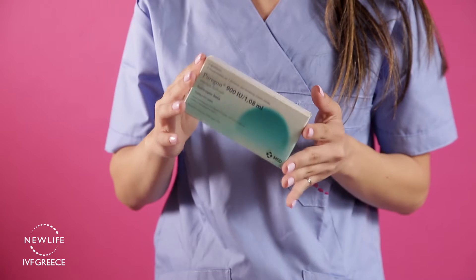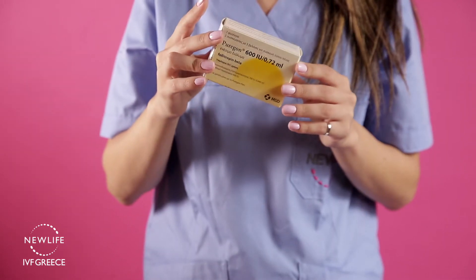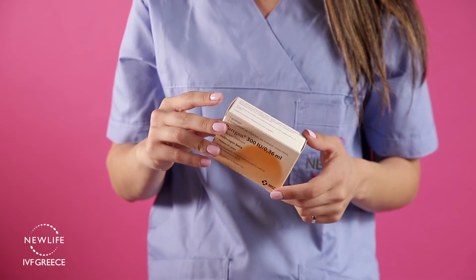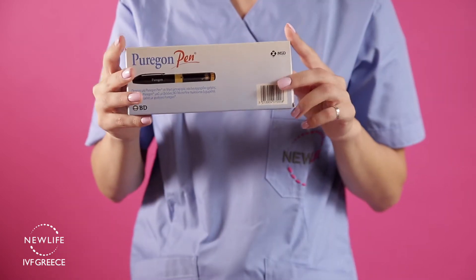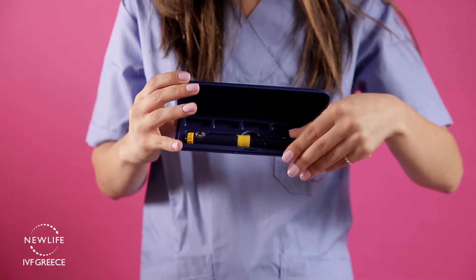Once you receive your medication, store it inside the fridge. Puragon injections can come in 900, 600, and 300 unit packages. For the injection you will also need one empty Puragon pen, sold separately in a protected case.